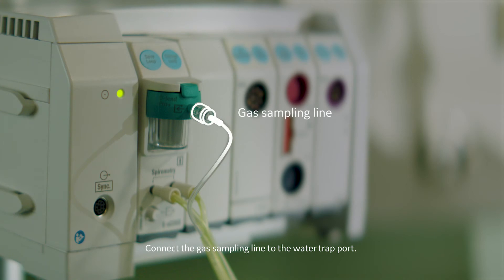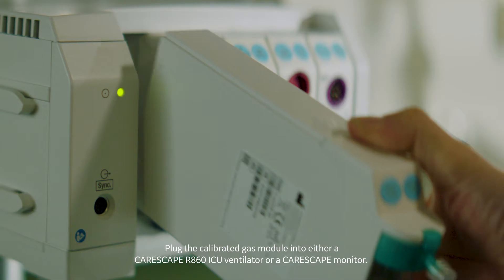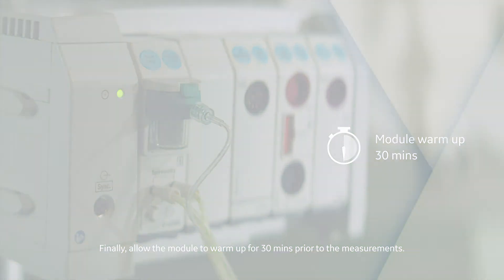Connect the gas sampling line to the water trap port. Connect the spirometry lines to the spirometry ports of the ESCOVX gas module. Plug the calibrated gas module into either a CareScape R860 ICU ventilator or a CareScape monitor. Finally, allow the module to warm up for 30 minutes prior to the measurements.